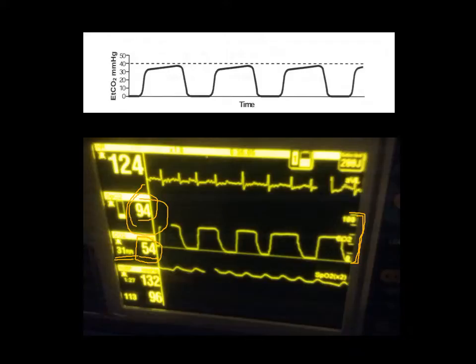So we just gave him some oxygen. At this point, that high carbon dioxide, that's not good, but he wouldn't tolerate CPAP or BVM, especially because that just hurt his rib cage. So we just had to manage him the best we could.